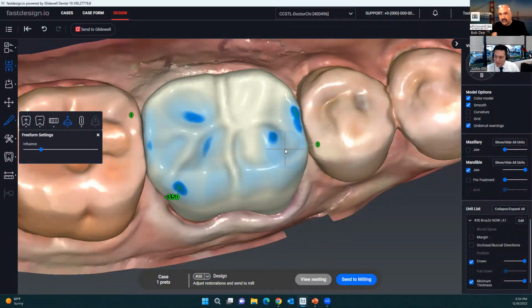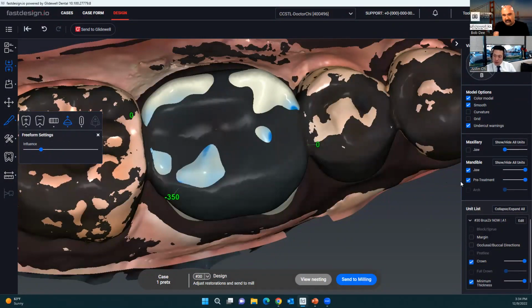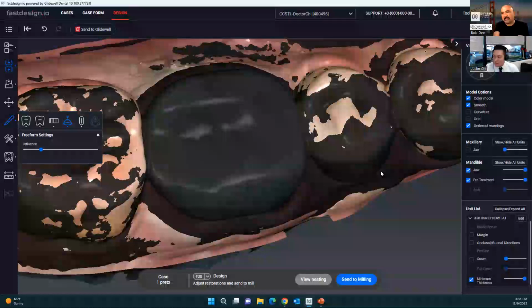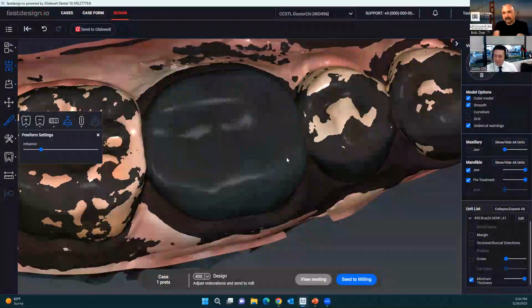And then on the right-hand side, I see that you have a pre-treatment crown as well, right? That's right. I do have a pre-treatment. What that pre-treatment is, is a scan of the preoperative tooth. And at all times, go on, Bob. I was going to say that in the last few months, I've started to do the scan with the method every time, because you can actually use the old crown's dimensions to try to get close to what it was, not necessarily exact, so the patient doesn't say, oh, it feels a little different. So it's a good tool.